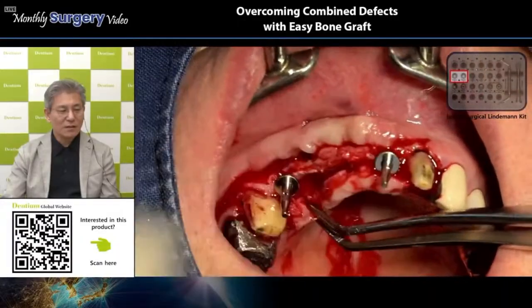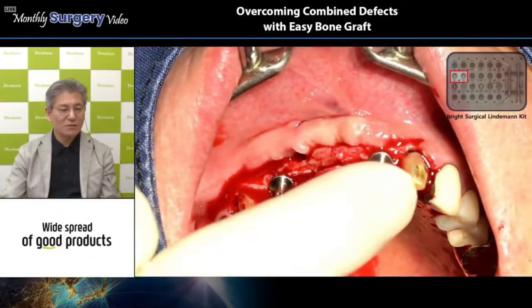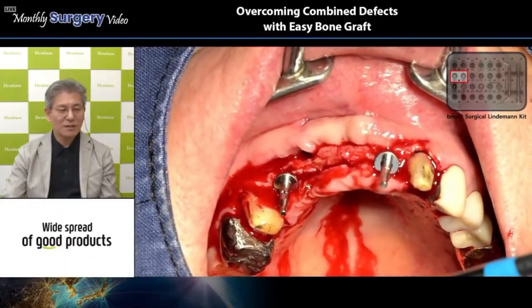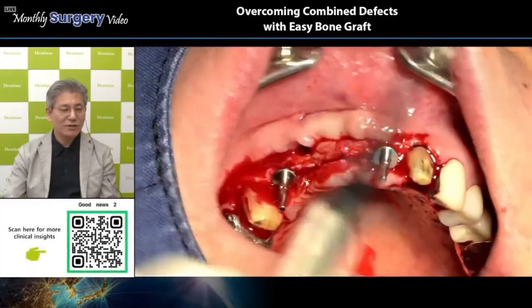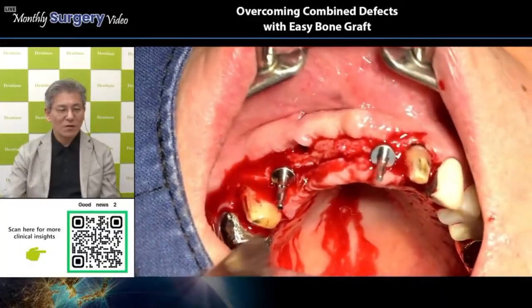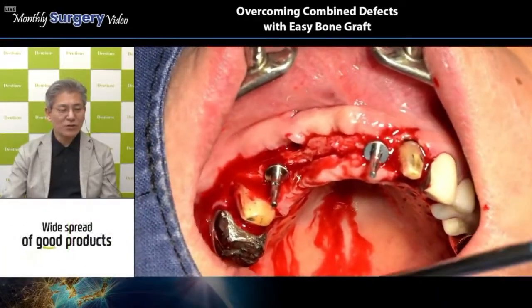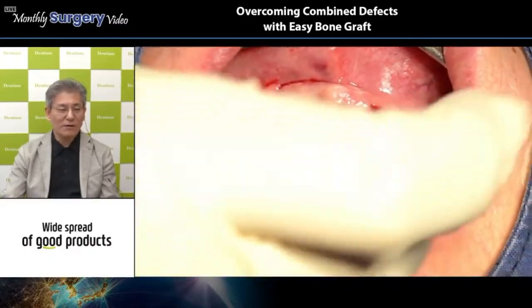Okay. Place the parallel pins here, 2 parallel pins, checking the path, angulation, and distance from the neighboring teeth. All of the 3-dimensional position was evaluated in this step, right?